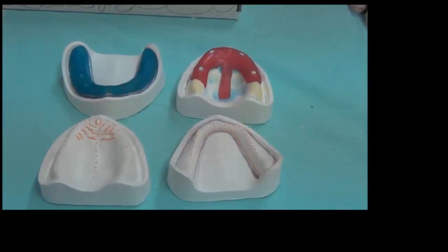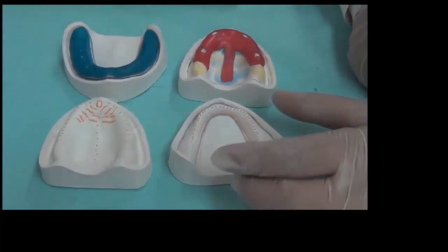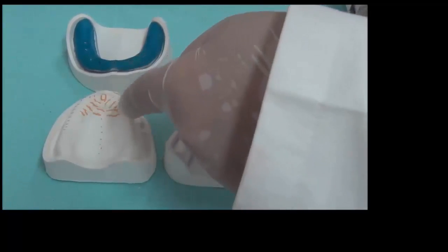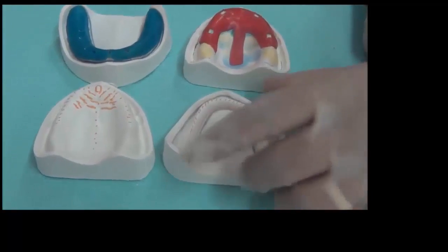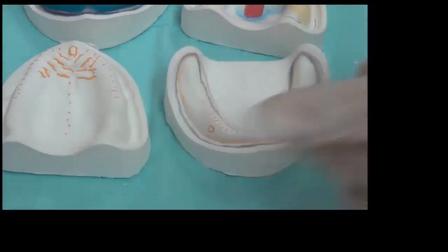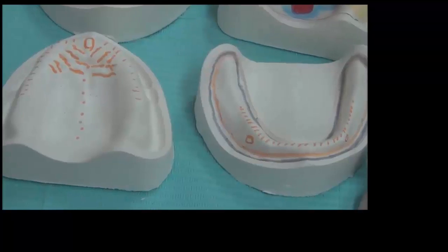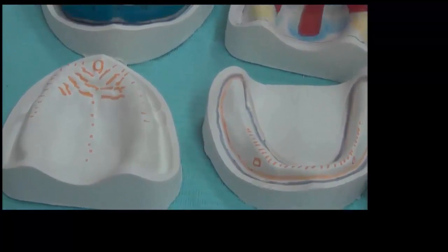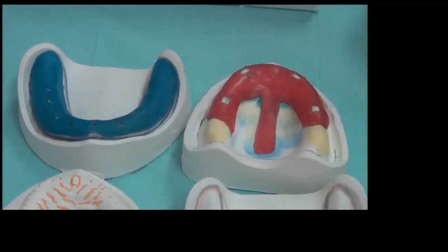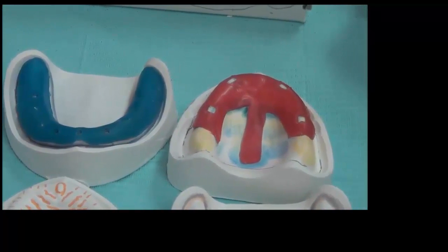So once I understood the different reasons why we need to relieve these areas in orange, these are all the relief areas in the upper and the lower. We now understand why we need to put a spacer. We could relieve in different ways. Putting a spacer and then removing it before impression does this relief.